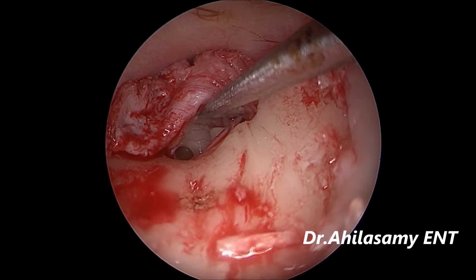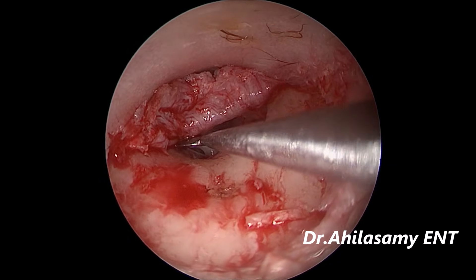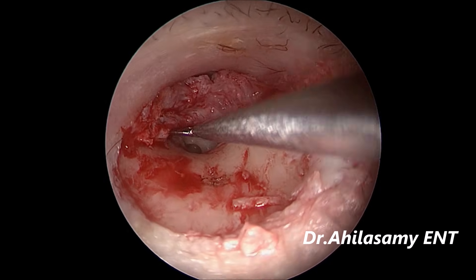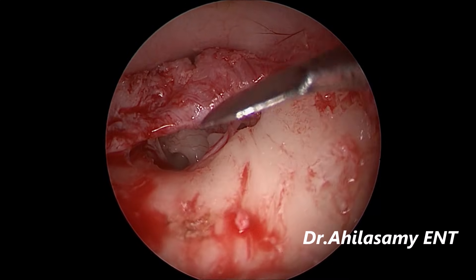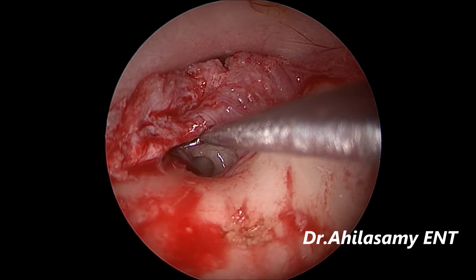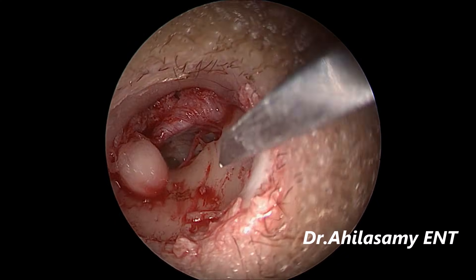The incudostapedial joint is seen and the malleus is seen. We have to have the full view of the incus and stapes, so the bony overhang has to be removed. Many use a drill — but with the drill the bony particles fly and it quickly fogs the view. With a curette it takes a longer time. So I use my own Dr. Aghila's endoscopic 1 mm chisel.